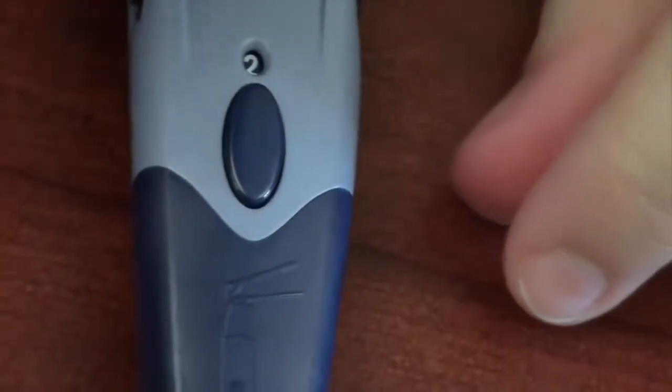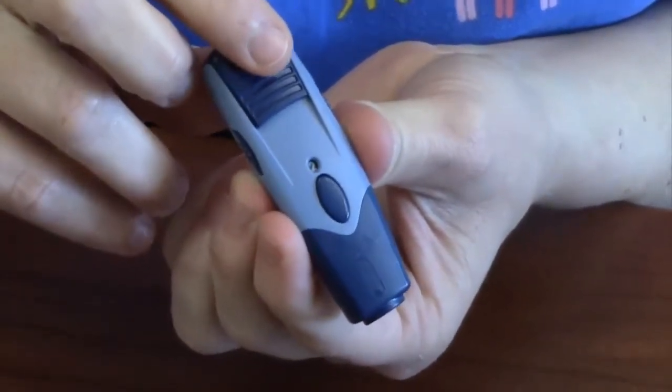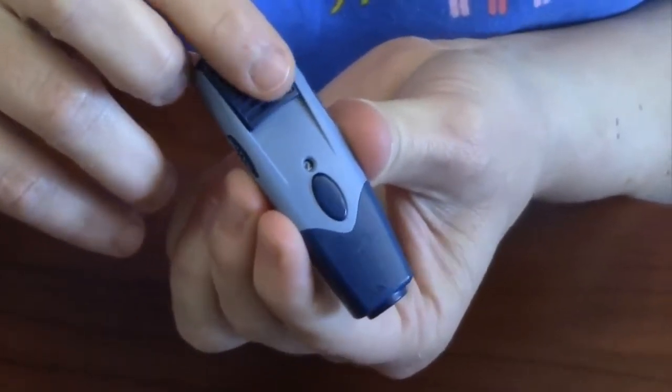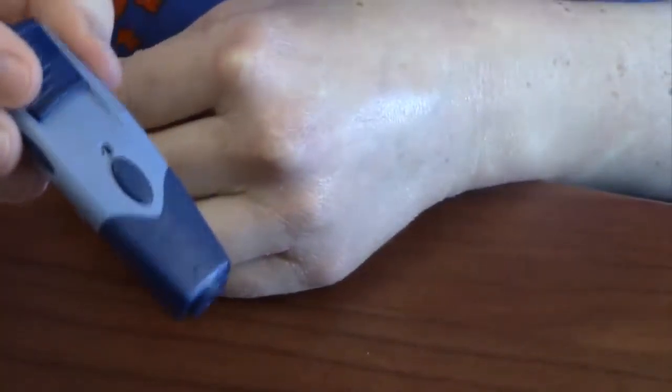You can use the wheel on the side to adjust the needle to the appropriate depth — we recommend a standard setting. If you need a bigger sample, you can go up to a higher number. Then pull back on the blue piece to get the lancing device ready to use. You'll hear it click, and then you can set it aside until you're ready.